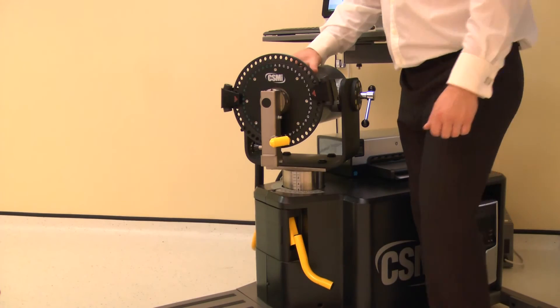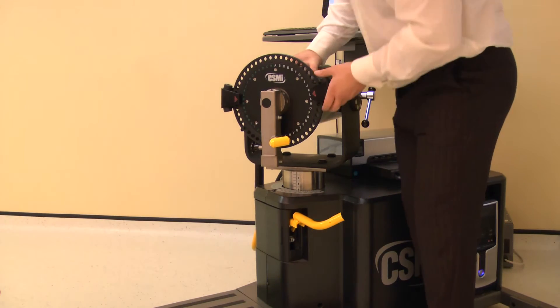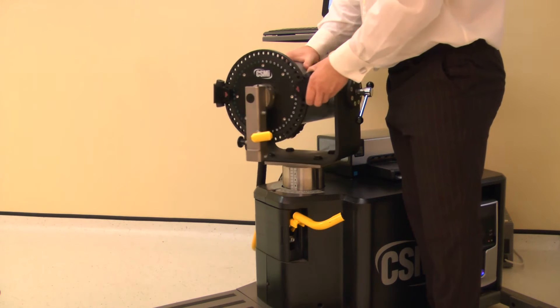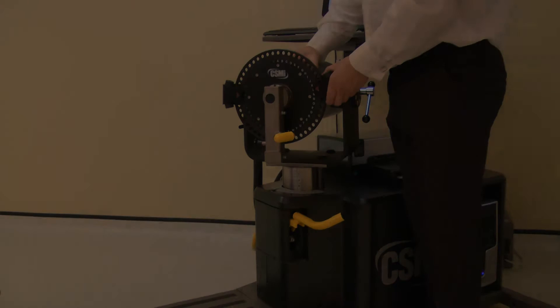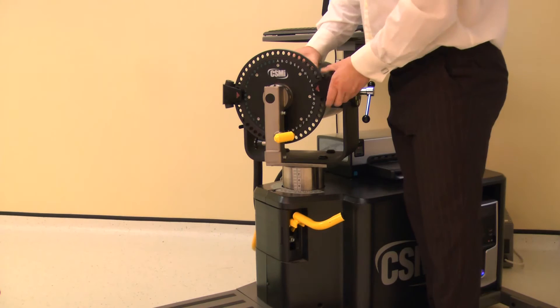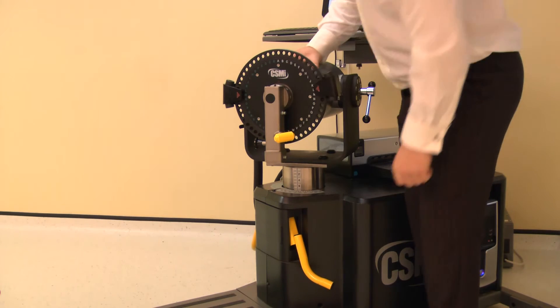The dynamometer height and rotation are adjusted together. Lift a locking handle to release. Rotate the dynamometer to 5 degrees on the black scale, whilst also adjusting the height to position 5. Ensure both locking handles are pushed down to secure.